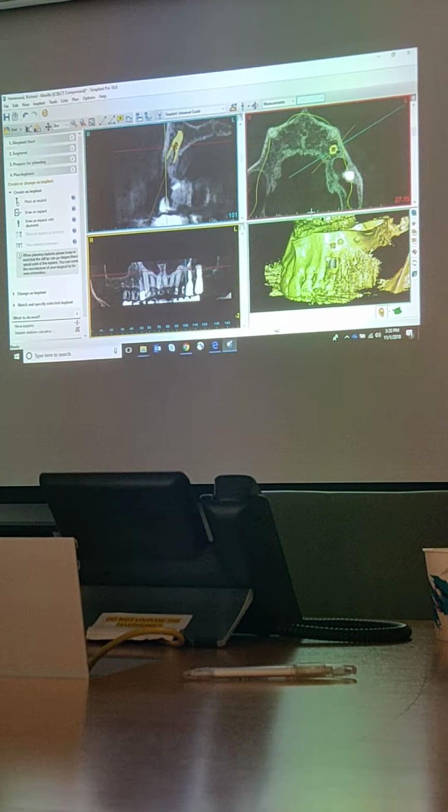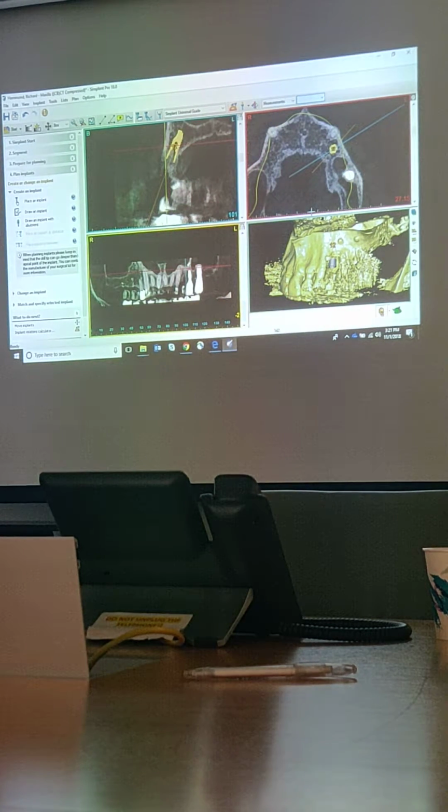When they bite down all the way on that, they're not going to go further. So we can control that from our standpoint rather than depending on the technician to do the 7 to 8. As long as you let them know, they have a specific bite stick within the scanner that is universal, so all we have to do is ask for open scans rather than closed scans. Okay, that's important.